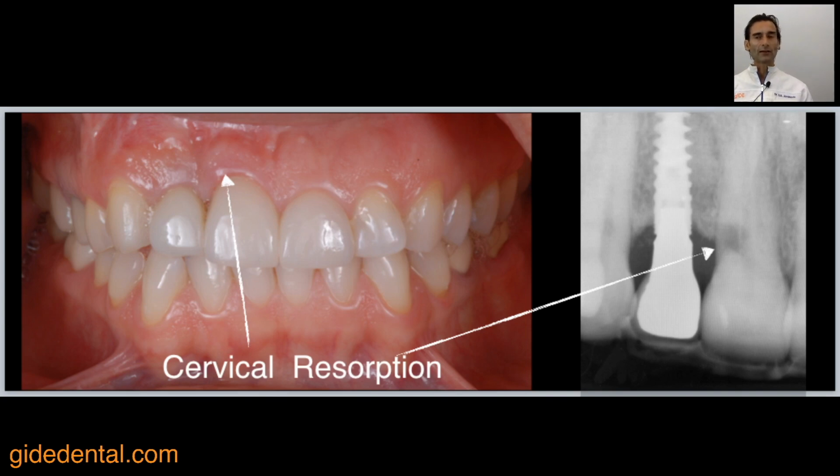And this is what we did in this particular patient, and the tissues are stable at the 4 month period, and really nice. I was hoping to show you the final, but the patient is not living in California, and unfortunately with the current conditions in the world, she was not able to come back here, but she's scheduled for the summer to come back after everything calms down.